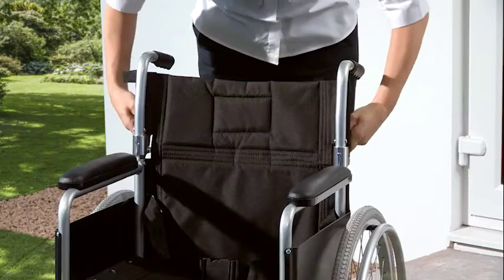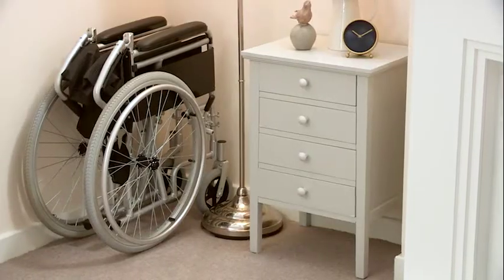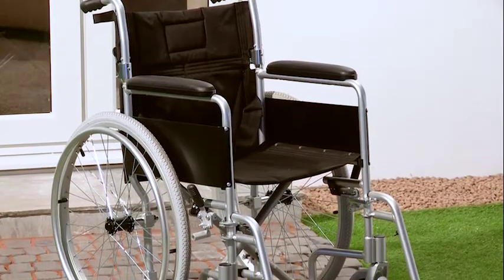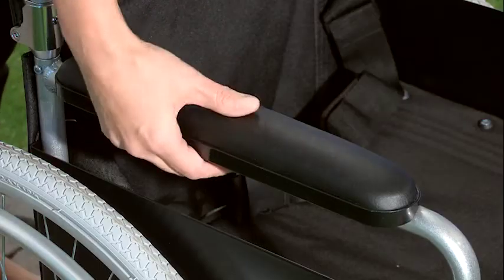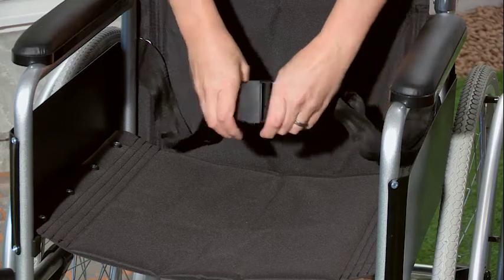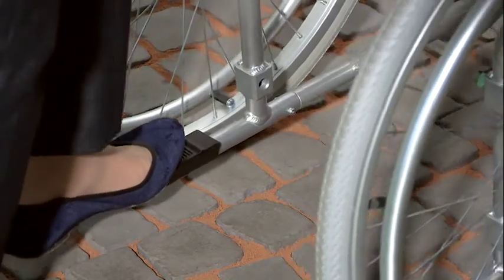It features a half-folding back that is simple to operate and makes it ideal for transportation and storage. The Superlite Self-Propel Chair includes full-length padded armrests, a lap belt for added safety, and rear stepper tubes to help attendants mount curbs safely.